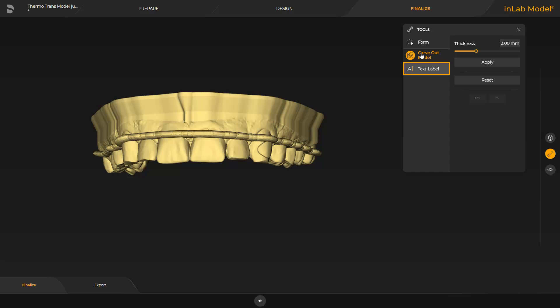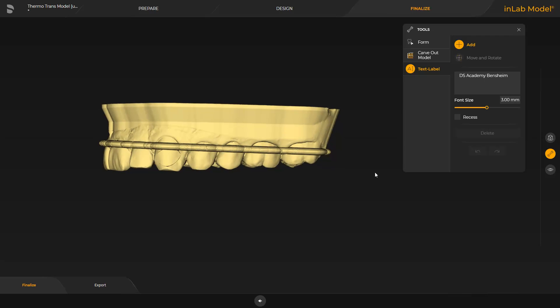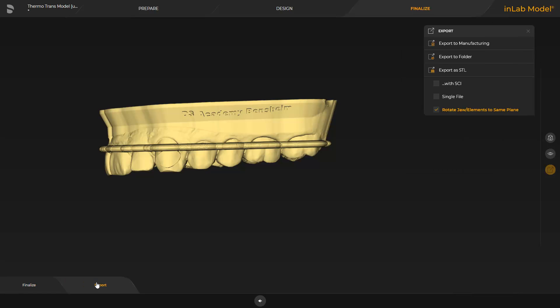Next, we proceed with the text label tool. To be able to better assign the model to a patient, for example, we put a text of our choice on the model. The text is put in place with a click of the left mouse button. We close the tool and switch to the last step, export. Here, different export options are available. Provided the PC with the InLab CAM software is connected to the same network and the CAM file order has already been determined, the model data can be seamlessly exported to the InLab CAM software by tapping Export to Manufacturing.